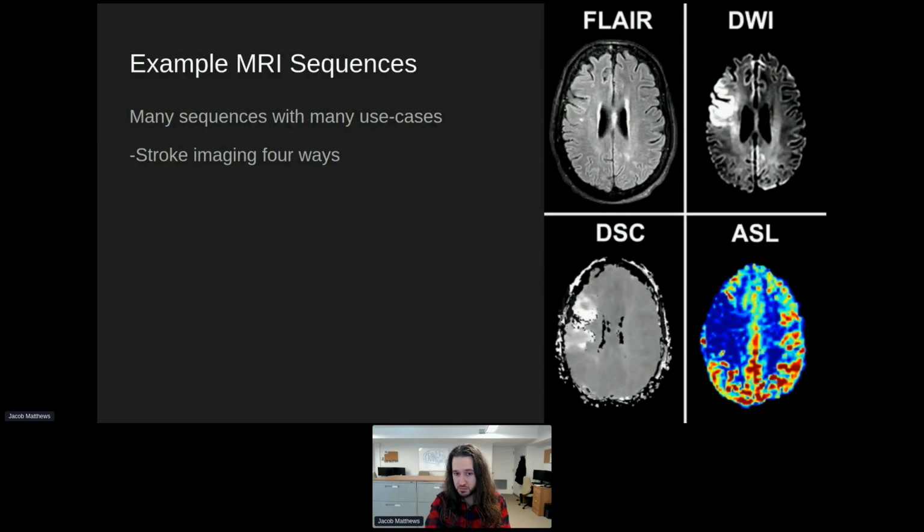In most of the healthy brain tissue, the contrast agent passes through and the brain is doing a good job of clearing that. It stays in the blood, it's not building up. But we see this bright region where the stroke infarct happened, and that's the contrast agent building up in this tissue. If it makes it that far, leaves the blood vessels and stays in the tissue, there's no active process happening here to remove that, and so we build up and generate this bright spot.